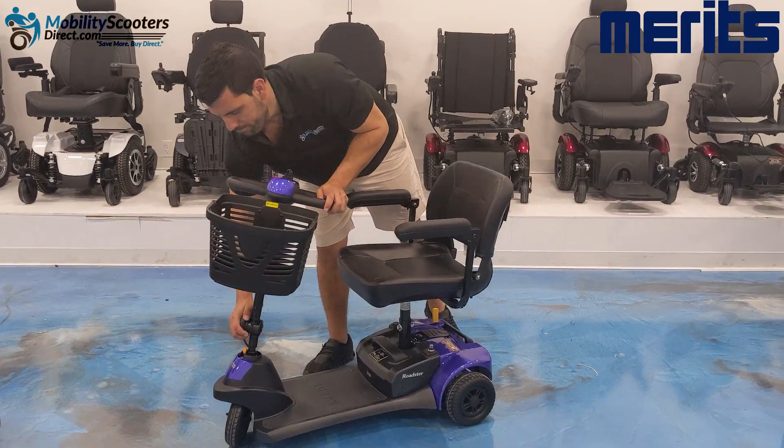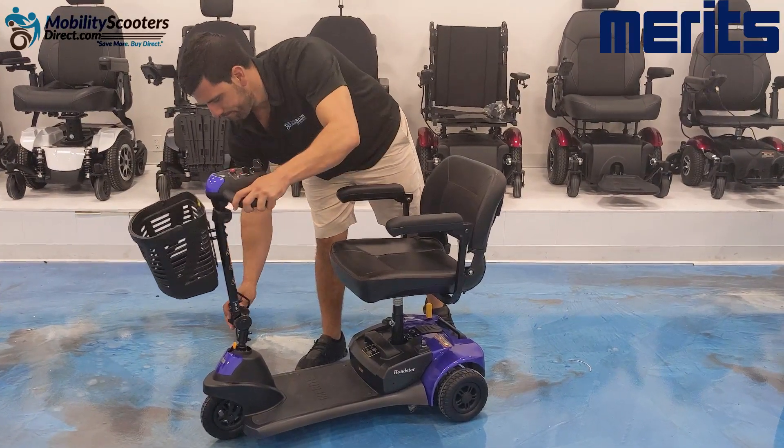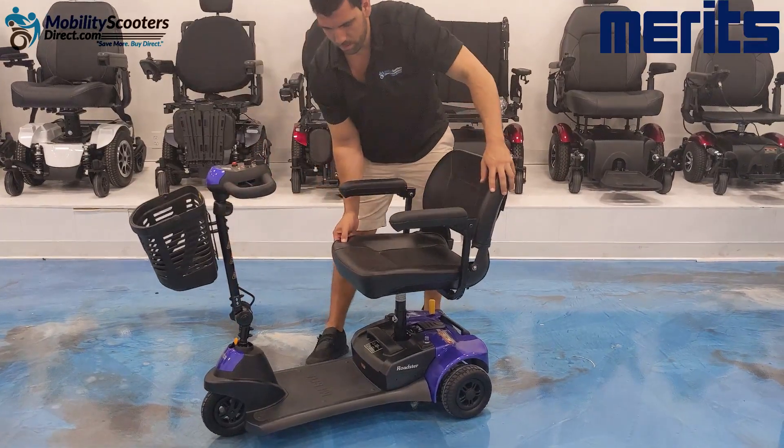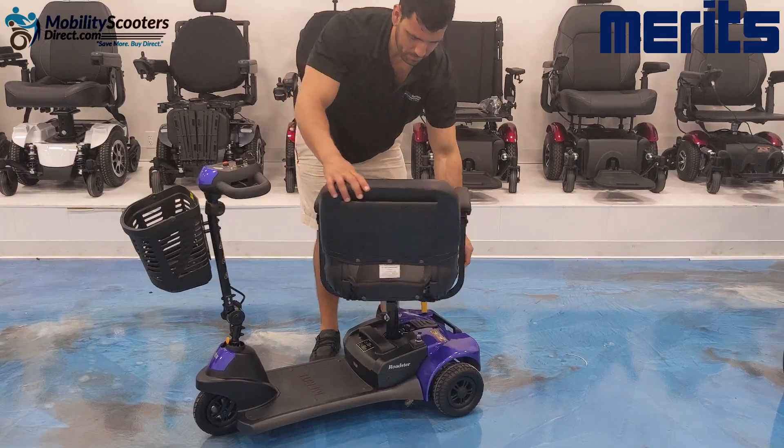You can also adjust the tiller by bringing it forward or back — simply loosen the tiller adjustment knob at the base and then re-tighten it. If you tilt the tiller all the way forward, you can rotate the seat 360 degrees.